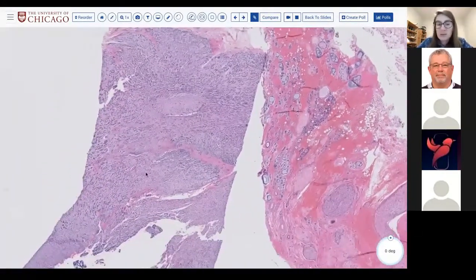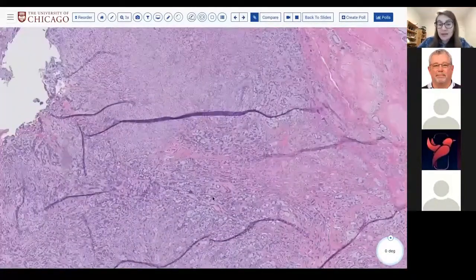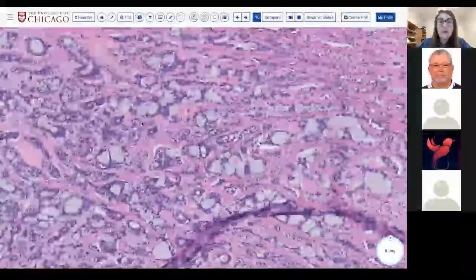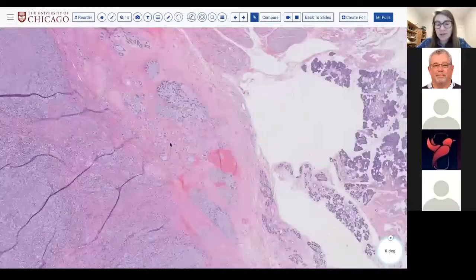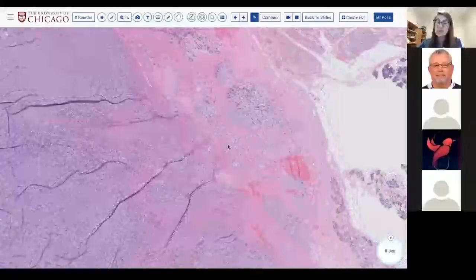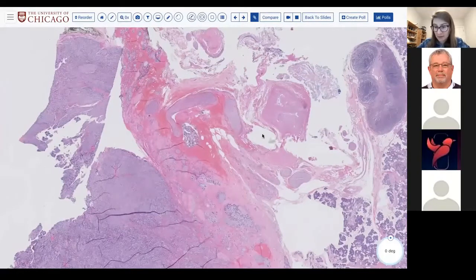So on core biopsy, one might say biphasic salivary type neoplasm. Differential diagnosis includes a pleomorphic adenoma with cribriform structures. However, adenoid cystic is certainly not to be excluded. If you feel very comfortable with adenoid cystic on the core, you certainly could say that. However, I would caution you that some pleomorphic adenomas can also contain cribriform-like spaces. And so for these reasons, I'm actually quite cautious on core biopsy with giving a definitive diagnosis, because I think it's best considered on the resection.